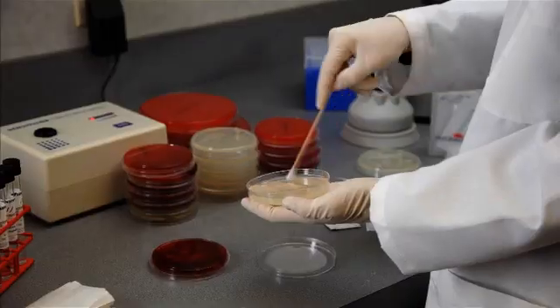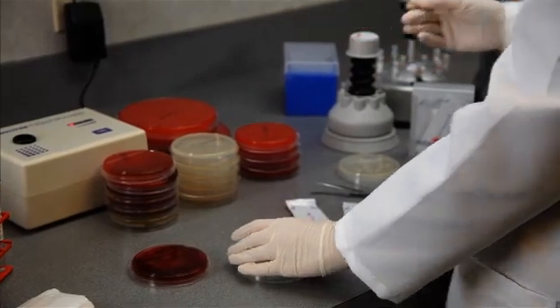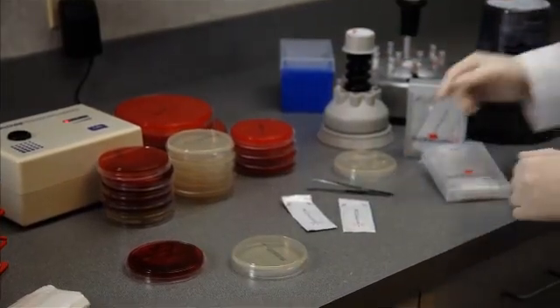Once inoculated, allow the agar surface to dry before applying strips. Use plates within 15 minutes.